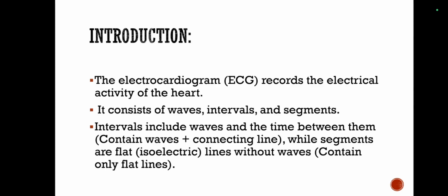First of all, intervals. Intervals include waves and the time between them, which means they contain waves as well as the connecting line. Next are the segments, which are a flat line without waves, which means they contain only the flat line, or baseline, or isoelectric line. So first we are going to see about the intervals.